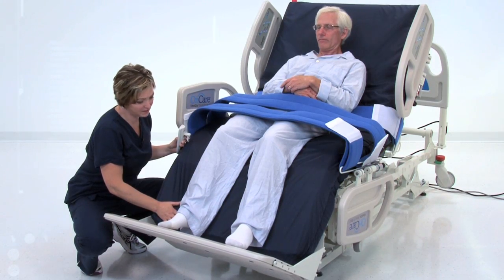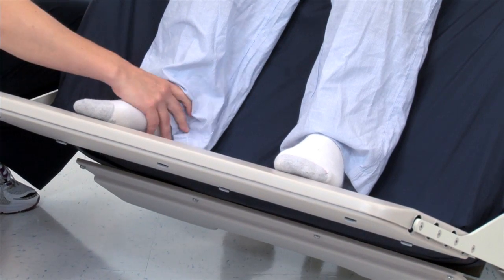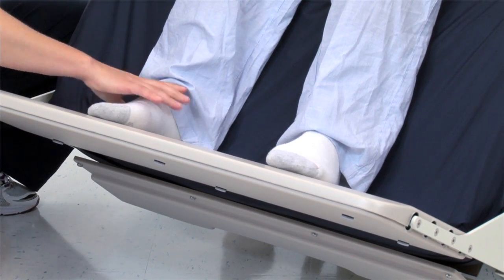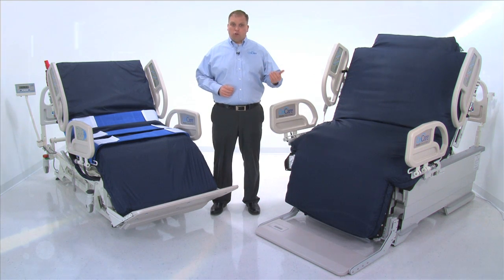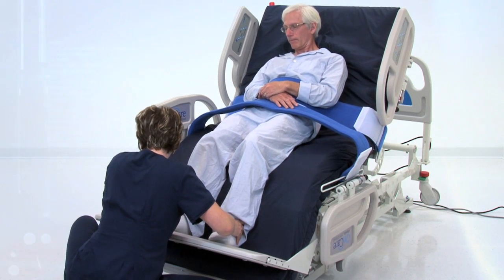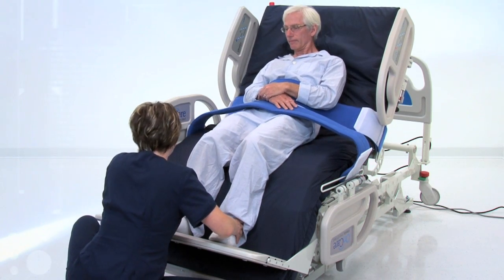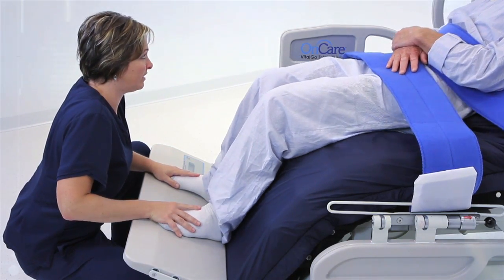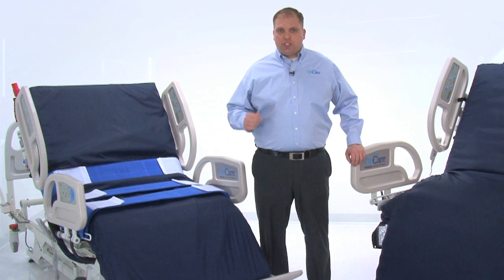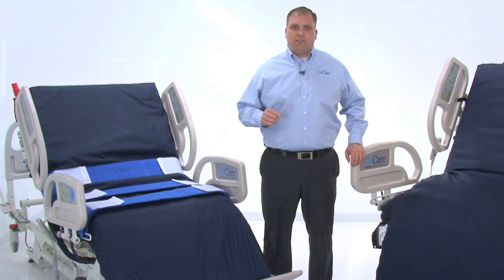Once the bed reaches an upright chair position, the patented foot lifter rises to meet the patient's feet and stops automatically when the feet are properly supported. This normal seating position provides security for the patient, improves dorsiflexion, and helps counter drop foot. The chair position also offers unique options for physical therapy. Once in a seated position with the foot lifter in place, a patient is able to apply pressure against the footboard. The chair settings of the Total Lift Bed can be customized to accommodate the needs of diverse patients.